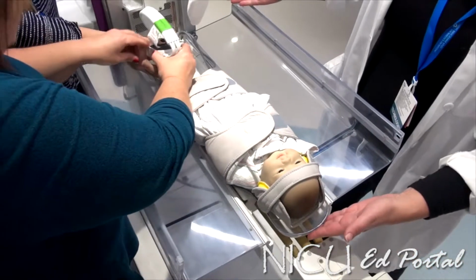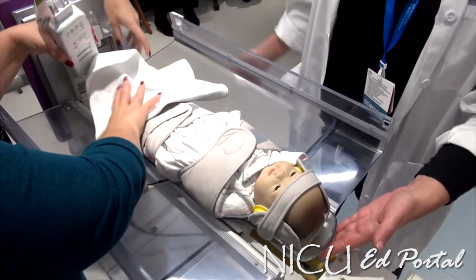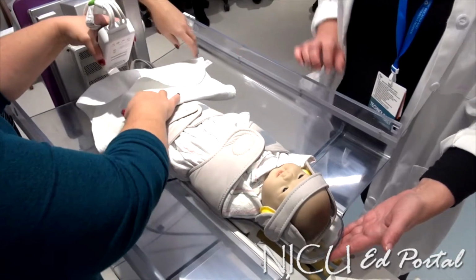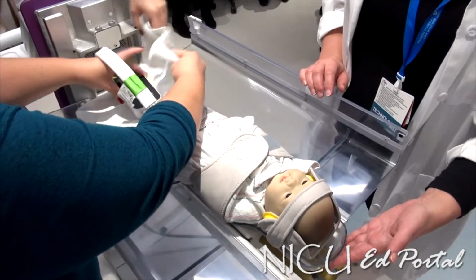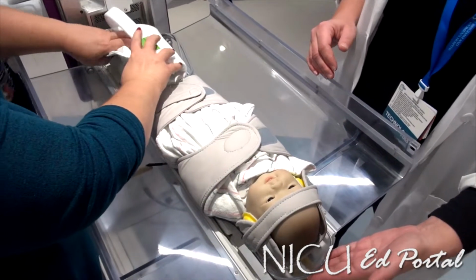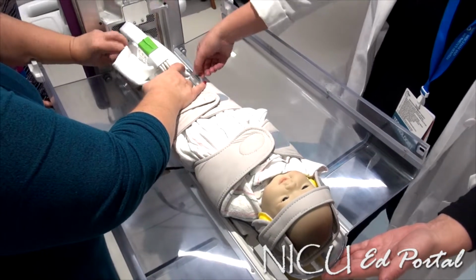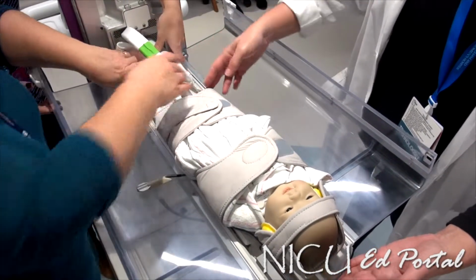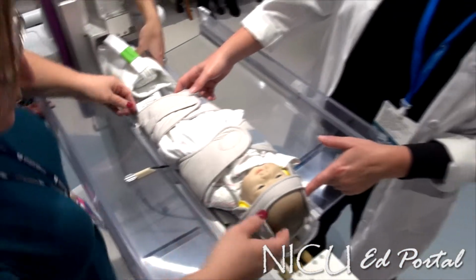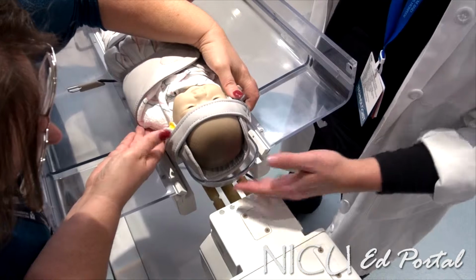And then what we do with these is this can stay in here, but we want to make sure that there's no closed loops. So we're going to put this down and then flip this in so that you can see there's a barrier between each layer of the coil, and then it's not on the baby. Just got to get it to lay right. Here we go. And we just want to bring the baby up a little bit more. Okay, sure, we can move him up. There's a center line here, and we want the middle of his head to be right in the middle there.